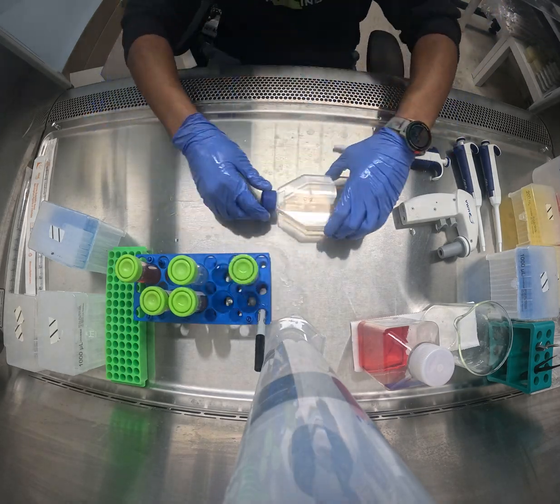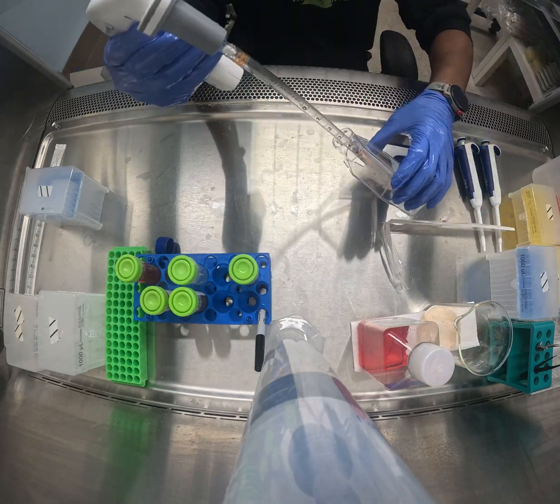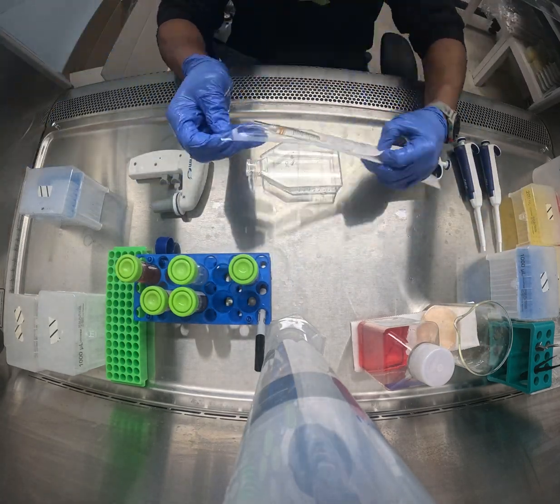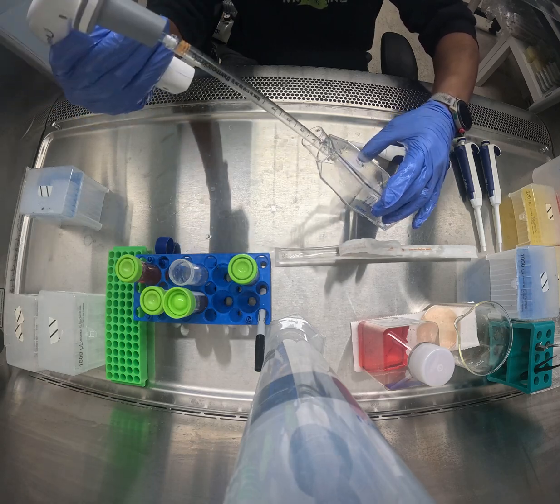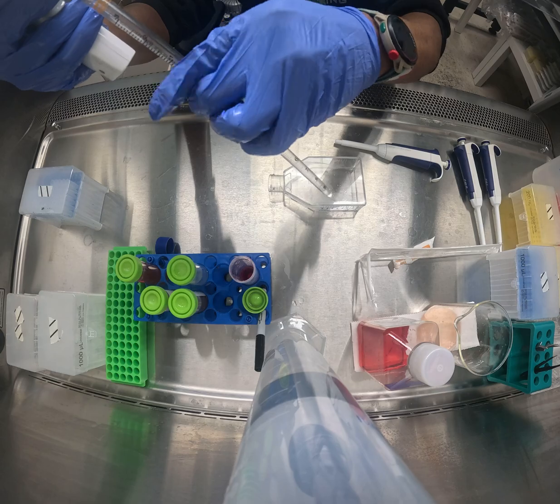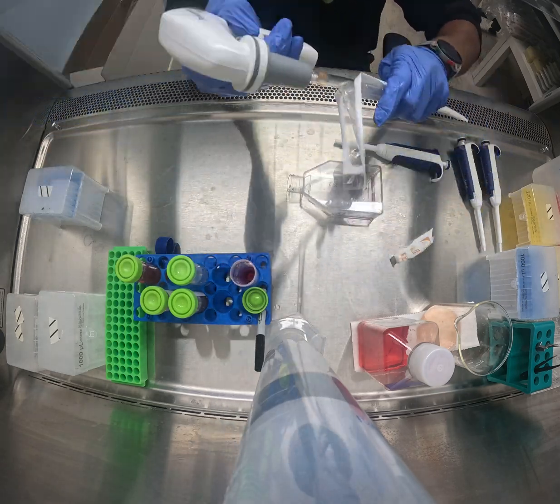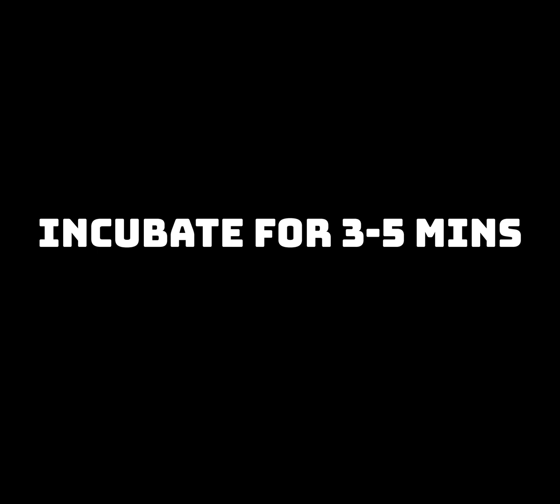Now, the first step of passaging cells will be detaching the cells from the flask. If using the small flask, use 1 milliliter of trypsin, or if using a large flask, use 3 milliliters of trypsin. Before adding the trypsin, remove all old medium and wash with DPBS. Then place this flask in the incubator for 3 to 5 minutes.